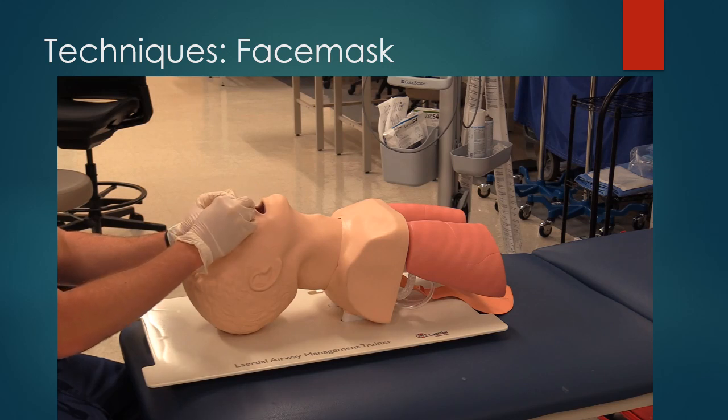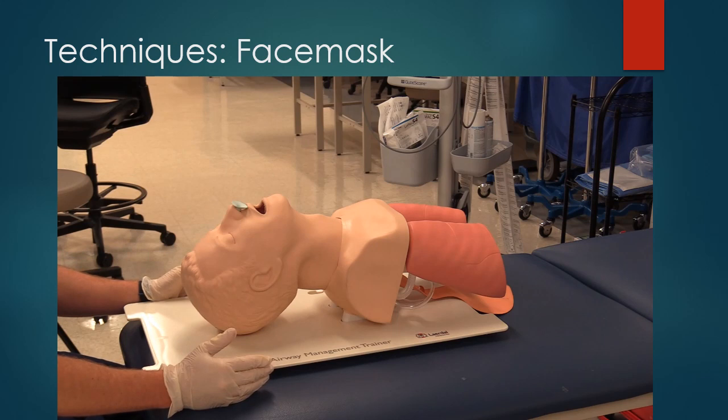I'd recommend not forcing these, as causing nasal bleeding is fairly easily done even with the nasal trumpets. Once in place, you can then resume bag mask ventilating or allowing the patient to breathe on their own depending on the situation.